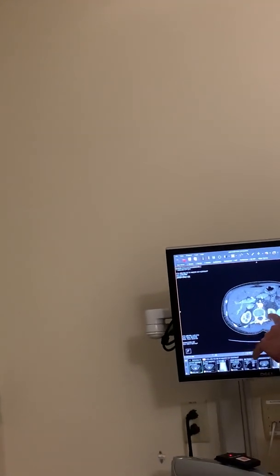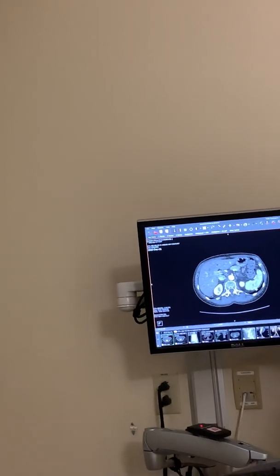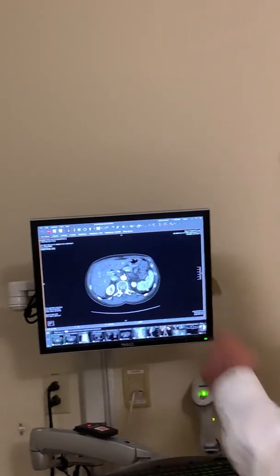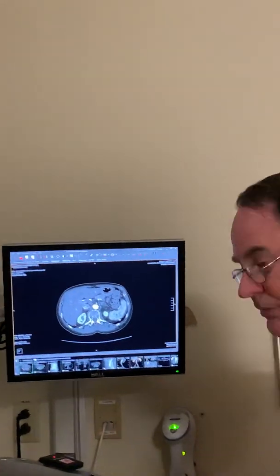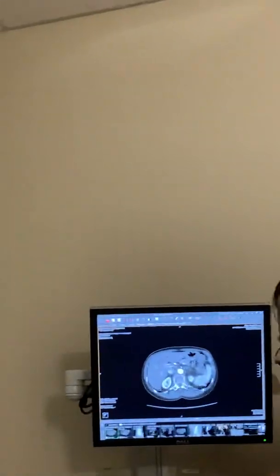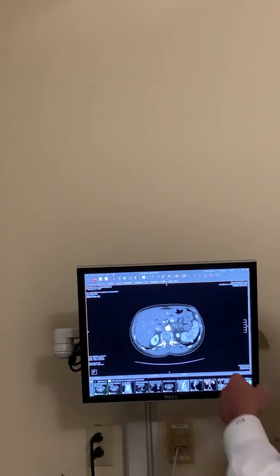It's right where it comes off the aorta. See how it looks kind of narrowed? Is that the aneurysm? No, the aneurysms are farther down. So what's narrowing? You've got some plaque. I saw it, but I wasn't planning to manipulate anything today.